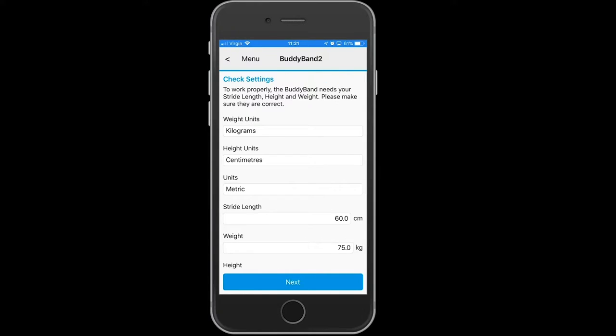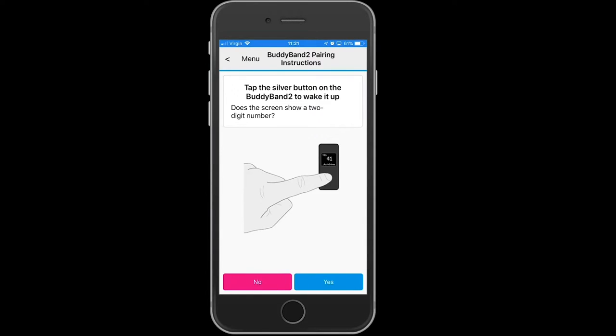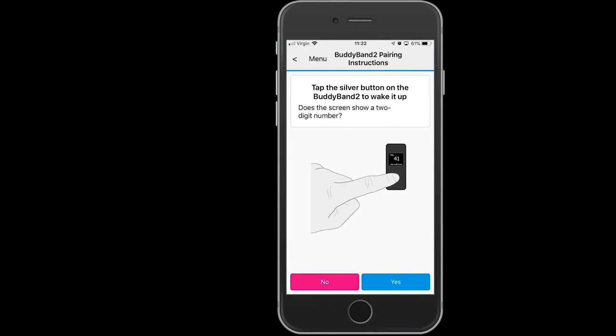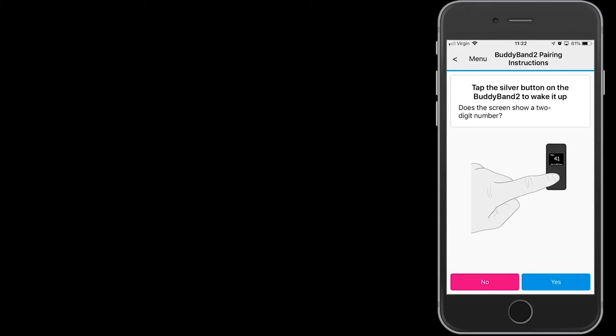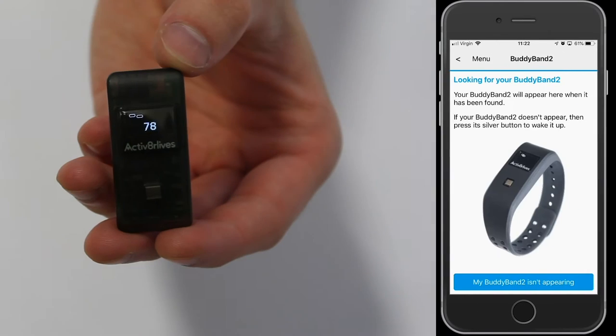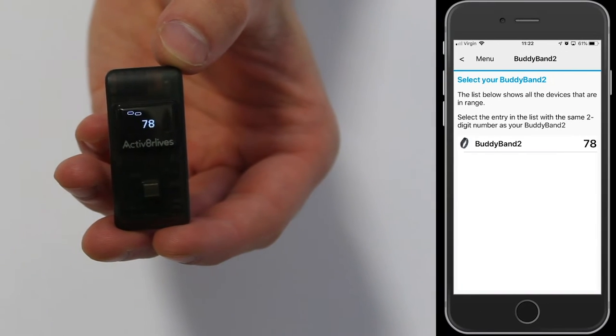It will ask you to check your settings. If these are correct, press next and it will go to the next screen. Wake up your Bodyband 2 by touching its silver button so that the screen lights up and you will see a pairing code similar to this, with two interlocking rings.